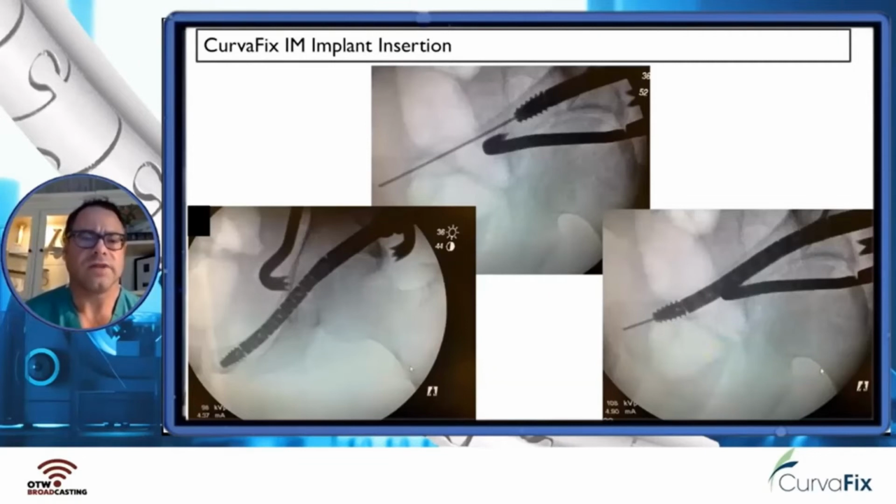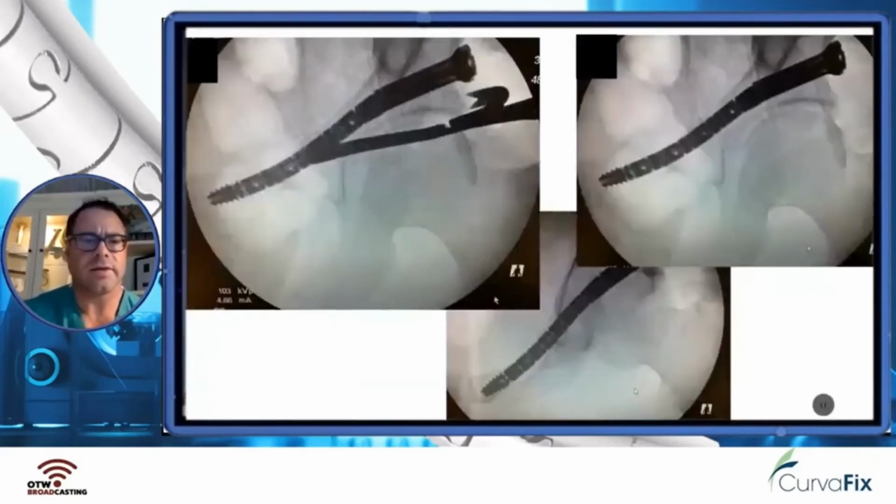One thing to mention, obviously, is you'll see that guide wire is different. That's after the exchange tube is used. The exchange tube needs to be inserted fully, so you can pull the steerable ball tip guide wire out and put this straight wire in. The straight wire will come out the very end of where you want it to come out, and not come out too early of the exchange tube and create its own new pathway, which would, I think, be just a sort of technical oversight. But this is the screw going in.